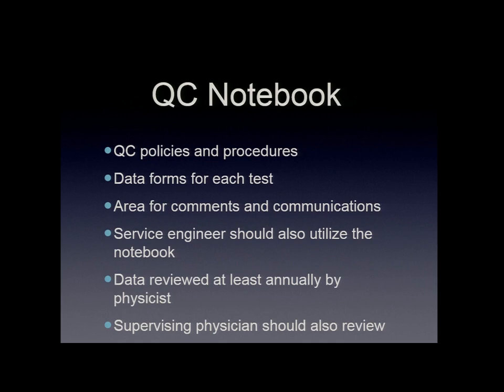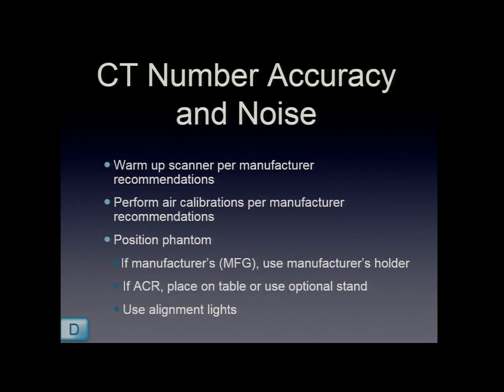But fortunately, that's something that the site can do rather easily and quickly. And the data needs to be reviewed at least annually by the QMP. It's also recommended that the physician review this as well, the notebook. All right, so here's some of the tests.